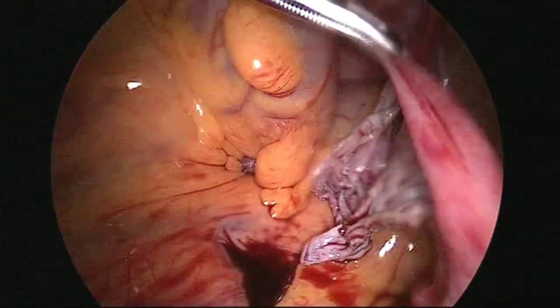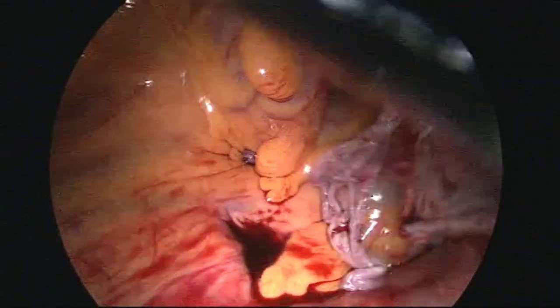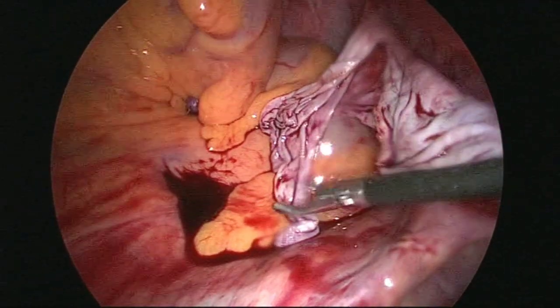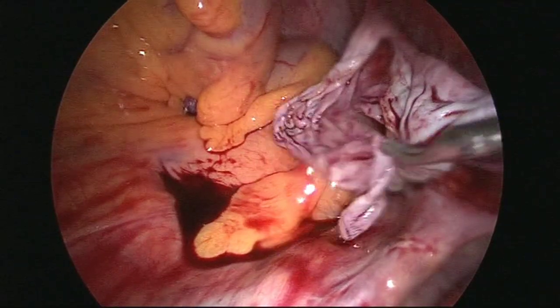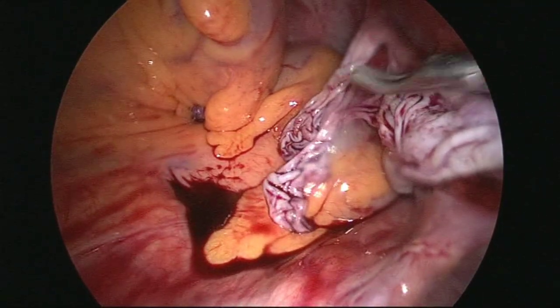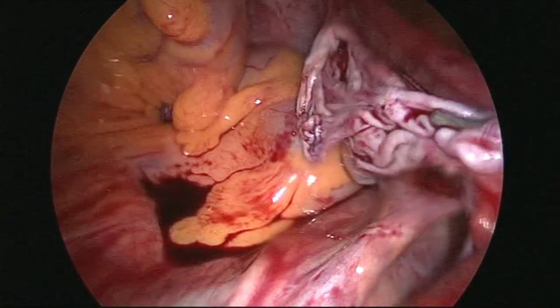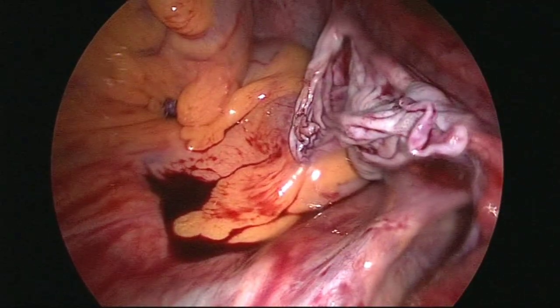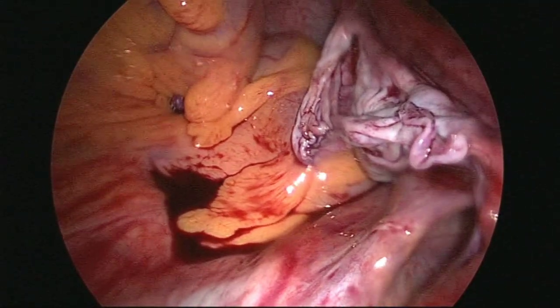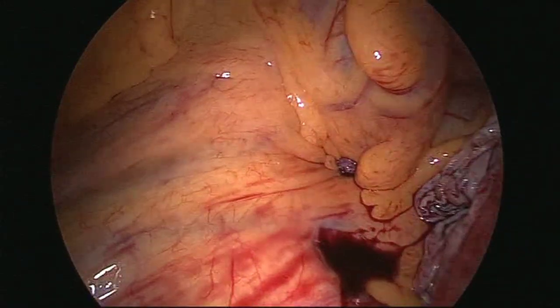This tube is not healthy. Pure ovarian tissue is remaining and no active bleeding is there. You can also see there is no active bleeding. Previously my plan was to suture it, but right now it's not required, so I left it. Okay, this is the one side.